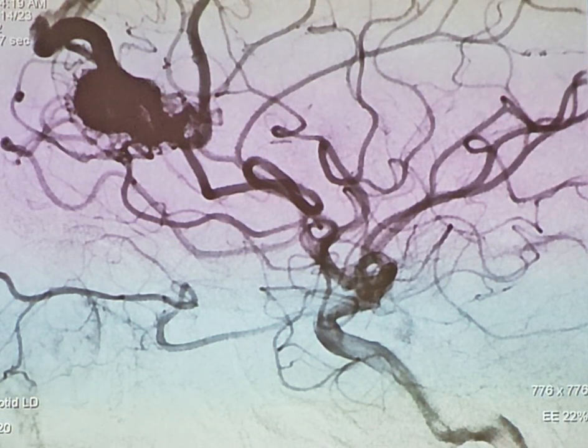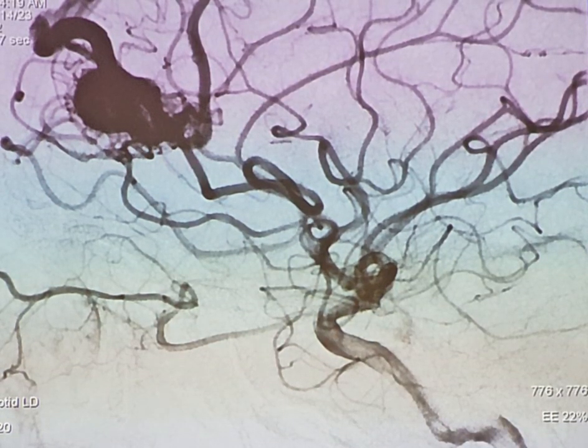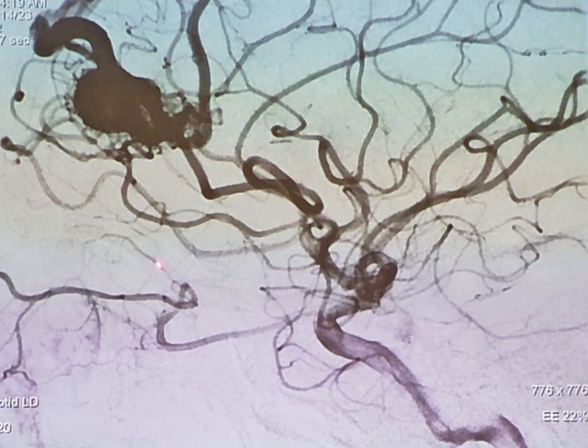I'm going to help you out. This is normal. This is a normal artery. Okay, so we've got the first segment, second segment, third segment, and we've got normal branches. What's this branch here?